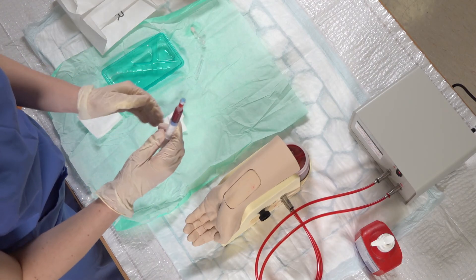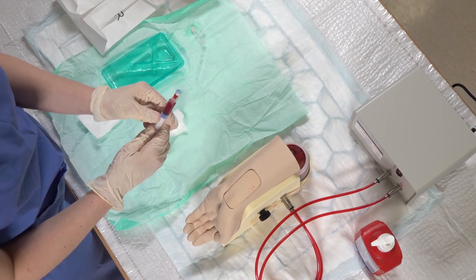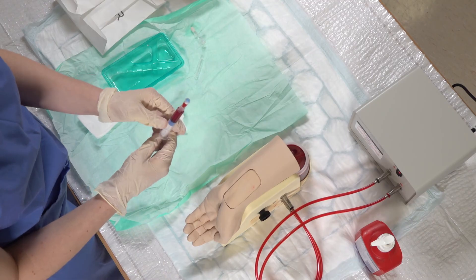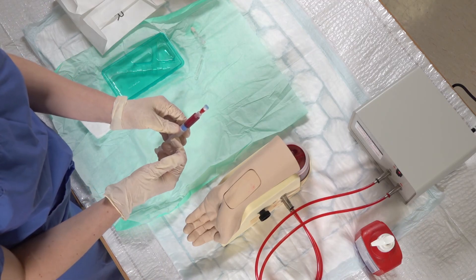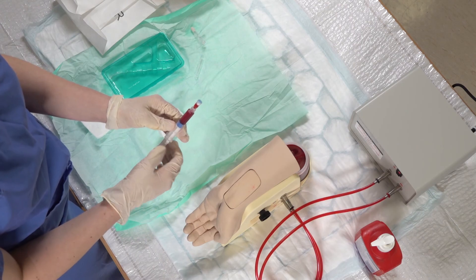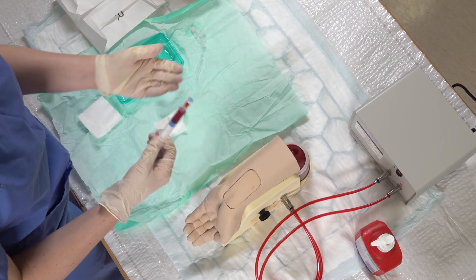You'll need to now run this gas using the point of care testing machines. When you go to those machines, you need to have two pieces of information with you: one is the patient details, and the second is how much oxygen they're on — the FiO2 — in order to run that gas.